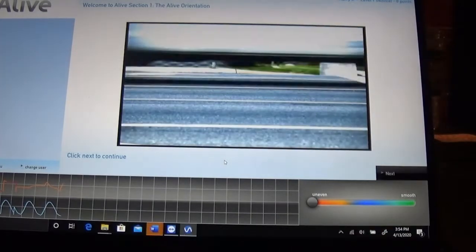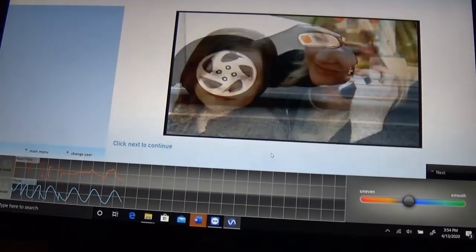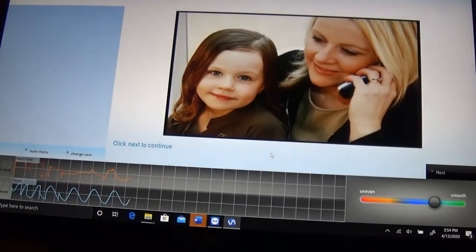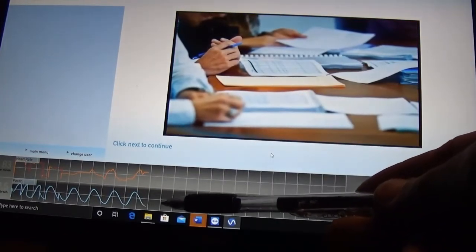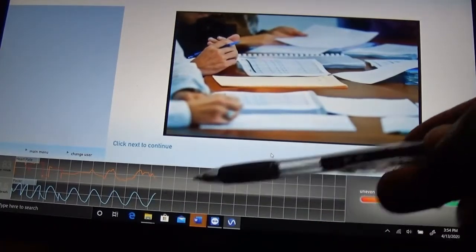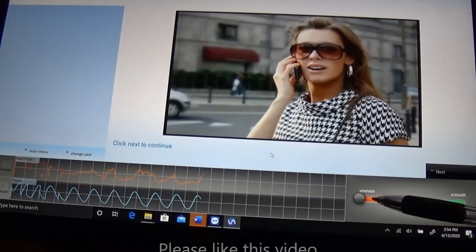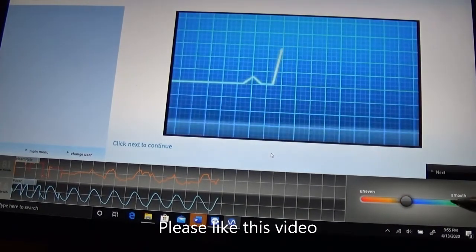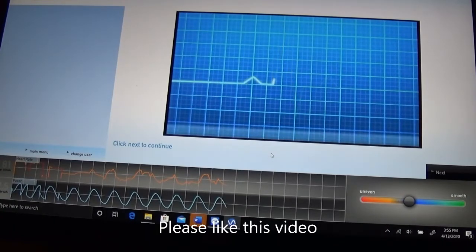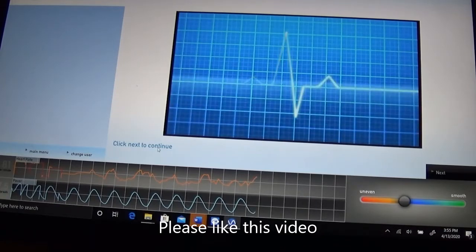You can see it has some nice video segments in the software — such as email needing a thoughtful reply, traffic jams, balancing the demands of children and work, and even finding time to see the dentist. We have too much to do in too little time. Day-to-day stress accumulates. On the bottom of the screen you see a breathing pacer and a heart rate signal. This is showing the level of coherence, from uneven to smooth, and you would ideally want it to be smooth.